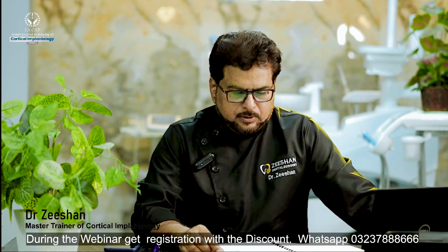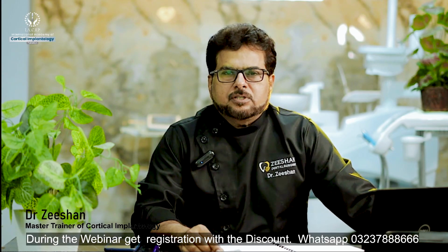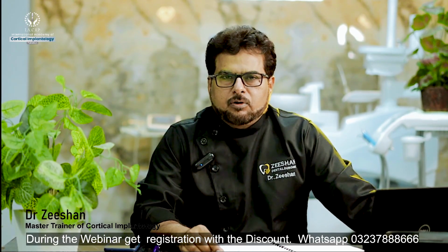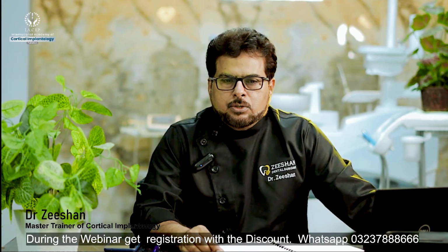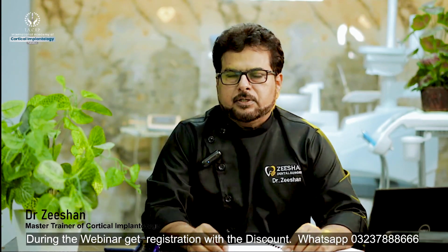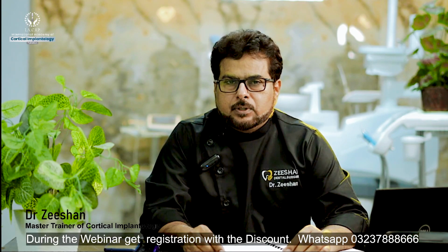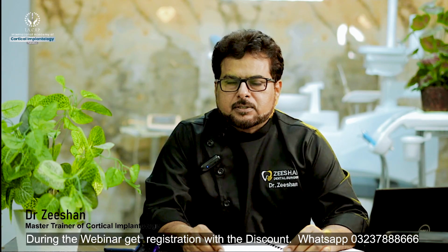with immediate loading, we are going to get the primary stability. Whenever we get the primary stability by using the implants, we feel more confident to restore immediately. So today we will discuss the factors which are going to be taken into consideration while choosing immediate loading in our practice. It's possible only when we know the basics of implant placement.